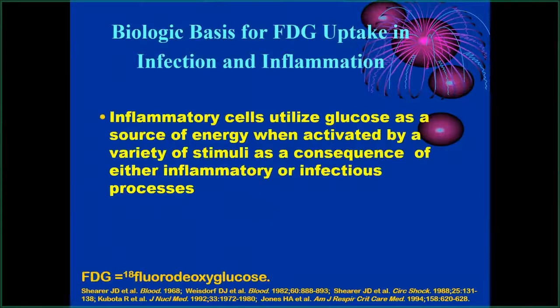First, we soon realized that not only is FDG taken up in brain matter, not only is it taken up in cancer tissues, but it's taken up in the inflammatory cells in various diseases and disorders that cause significant accumulation of macrophages and other inflammatory cells.